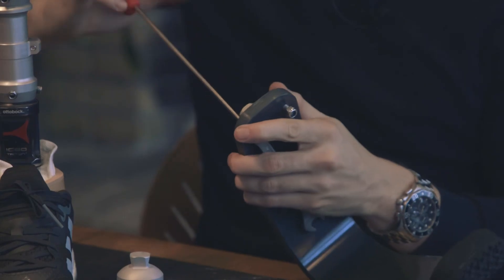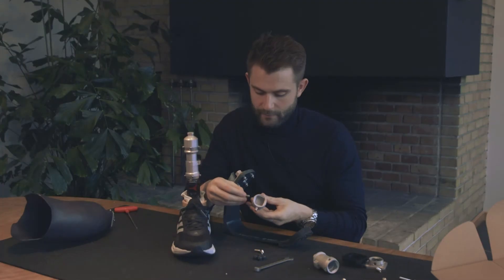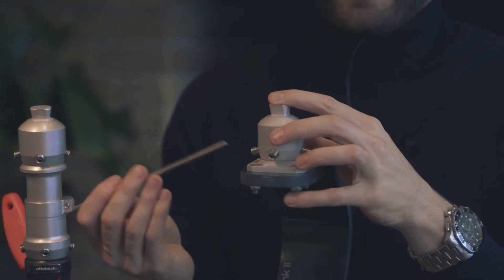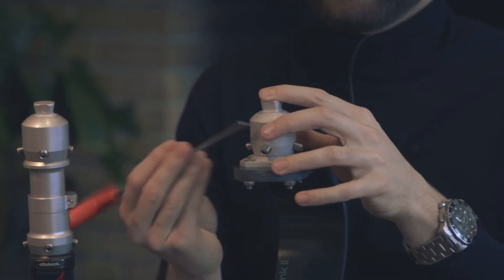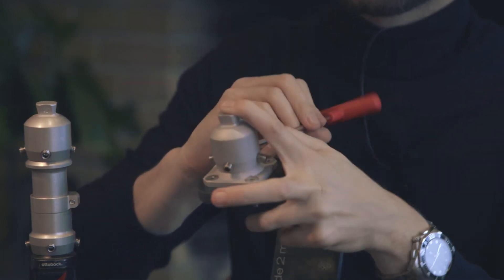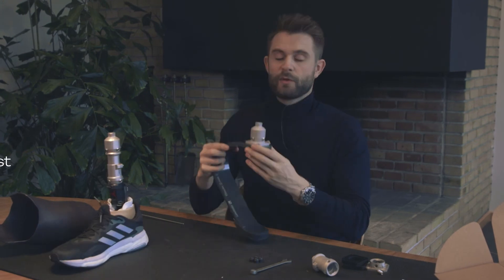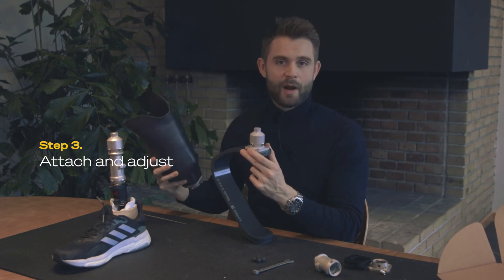Use your allen key. Put the screws into the holes, then start by putting all the screws the same distance in. You can now see that we have the two feet at almost similar height. What you need to do now is mount it to your existing socket, and then we need to play around in order to get the alignment right.